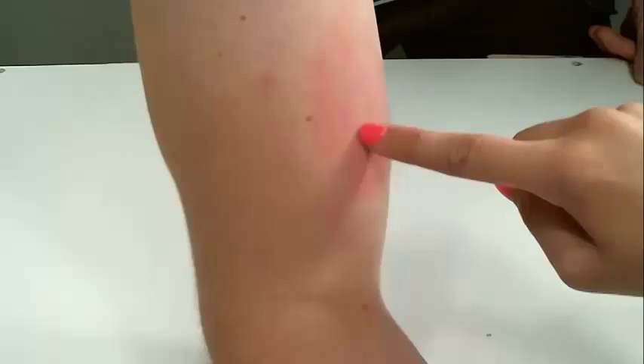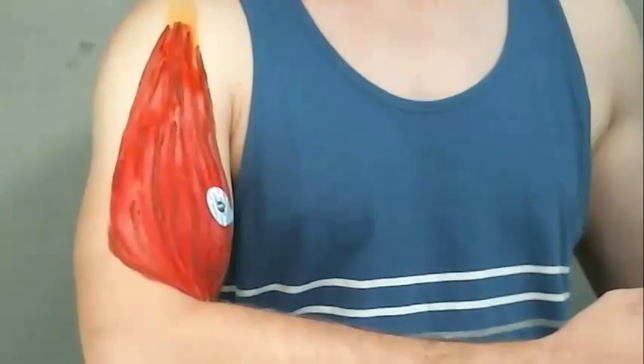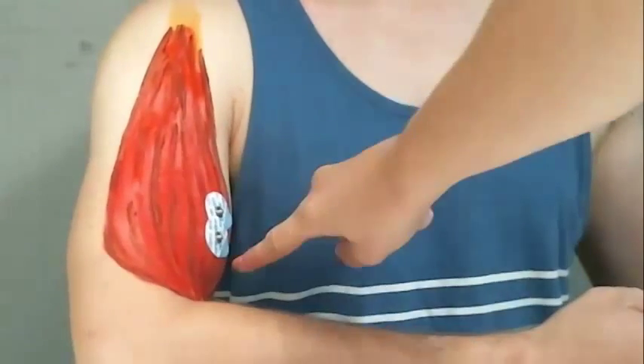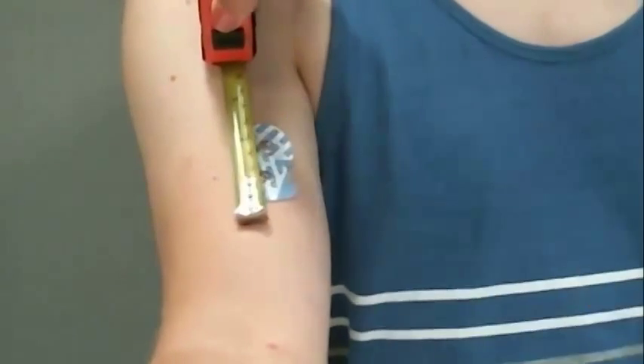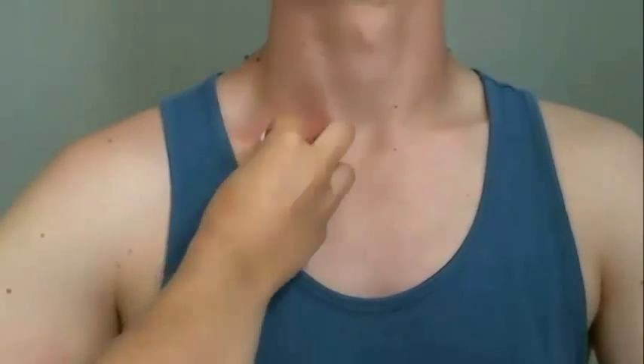Now you are ready to place the electrodes. Two electrodes will be placed along the belly of the muscle in line with the muscle fibers. This orientation of electrodes will reduce crosstalk or noise between electrodes. Leave a space about one to two centimeters wide between the centers of the electrodes. The final electrode will be placed on the bony ground area.